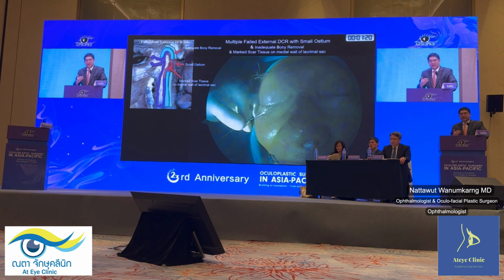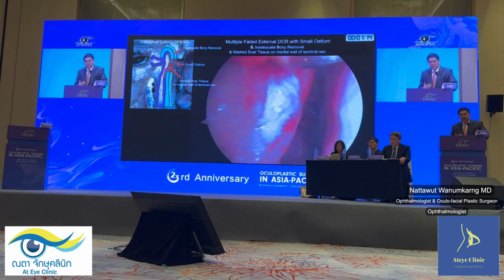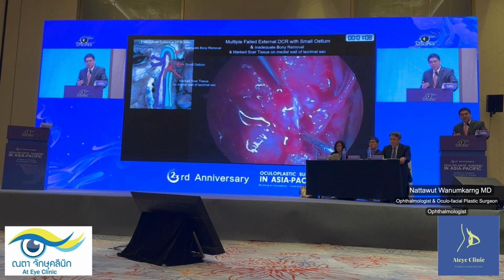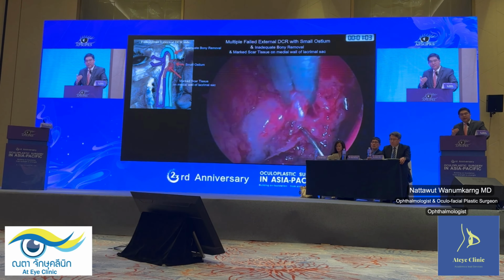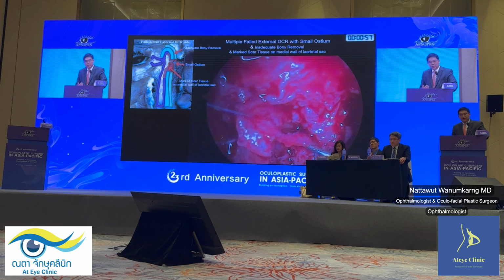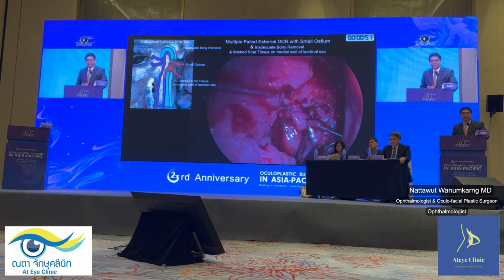So keep in mind, for the surgeon intraoperatively, we have to fight a lot in this condition. We have to do the vertical incision, remove the very thick scar tissue underneath the nasal mucosa, and sometimes we need to remove the thick bone. In the medial aspect of the lacrimal sac, we found a lot of scar tissue. If we approach this with the conventional endoscopic DCR, I'm pretty sure in this condition they're going to have a high percentage of failure.